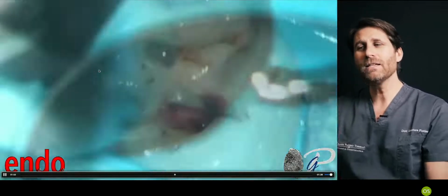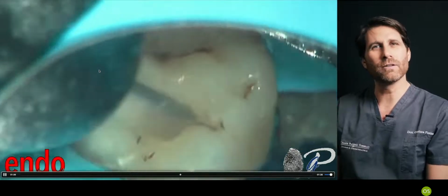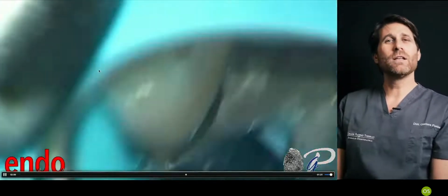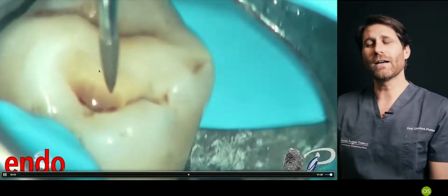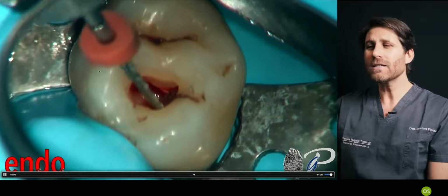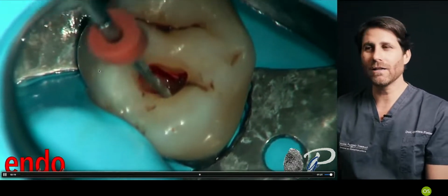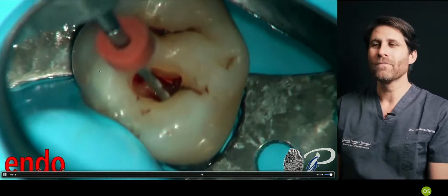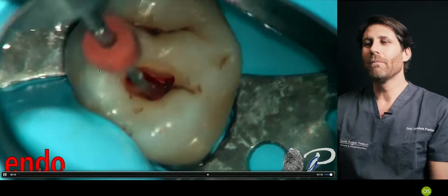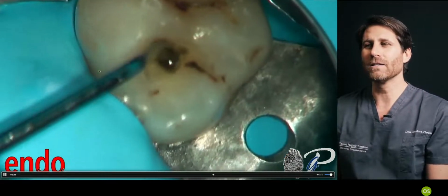Let the instrument give you feedback when you start the instrumentation, when you start the scouting, the glide path. The instruments will give you the feedback for your access cavity, how big it should be. As soon as we can start, I like to start with mechanical files, mechanical instrumentation. We will see it in the part specifically dedicated to this. But I like to start with the mechanical instrument to have feedback from it.